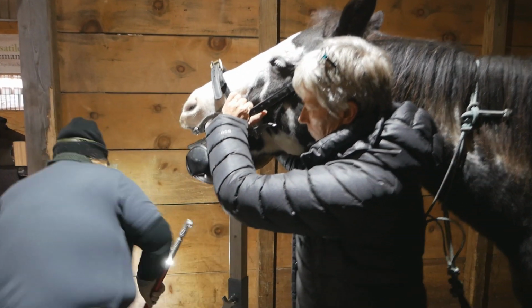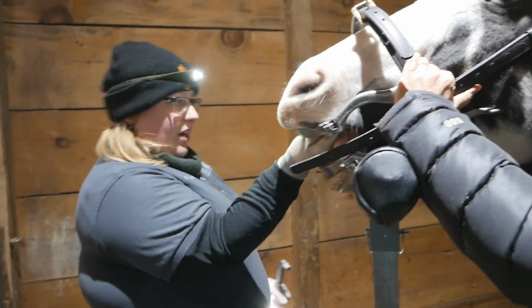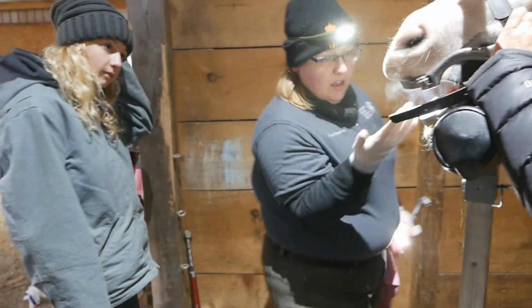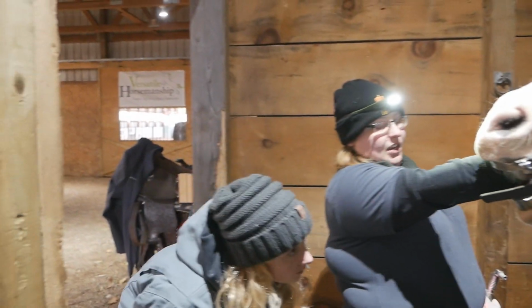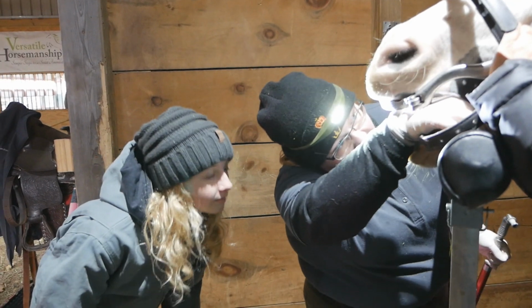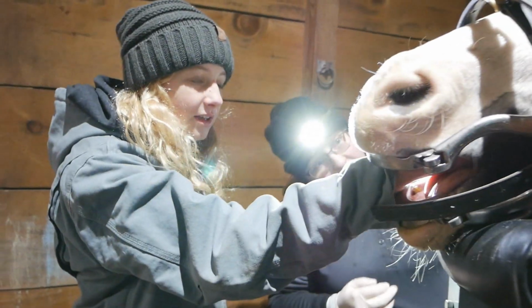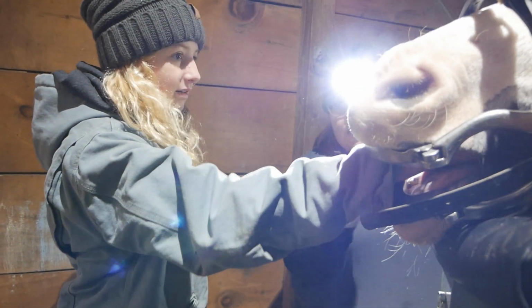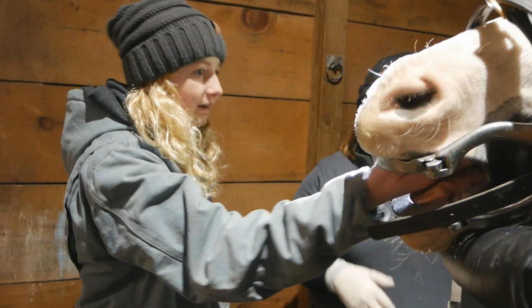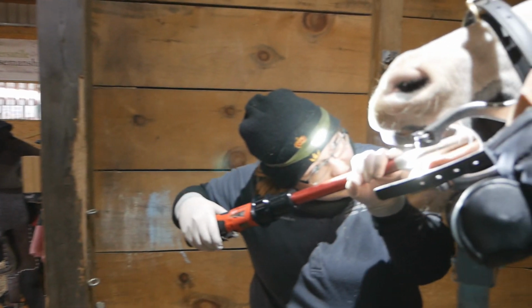And you know, before we're done, do you want to take a feel of the sharp points and then the feel after? So I ground down these ones on this side already. But if you take your hand and put it in his mouth and feel the outside of these teeth, and then see how sharp those are. Just kind of stick it in there. Do you feel the kind of jaggedy points? Yeah. So we'll grind those down and then I'll have you feel and see what you think.